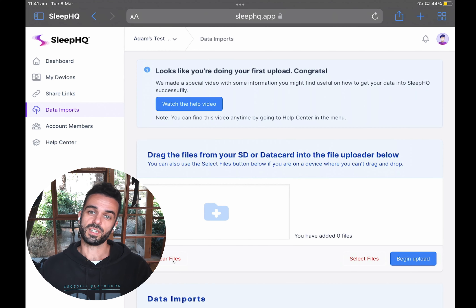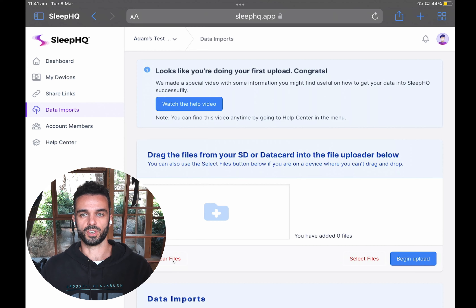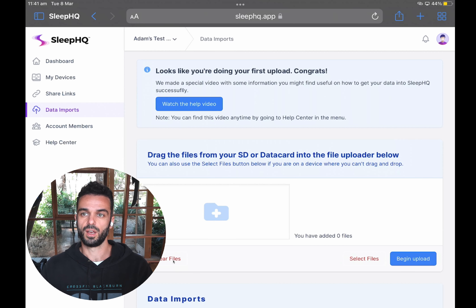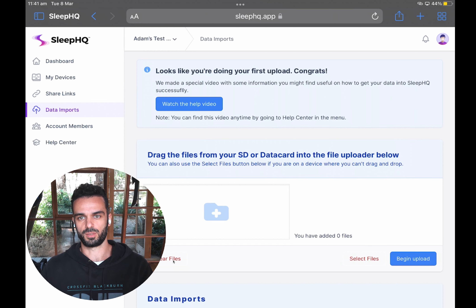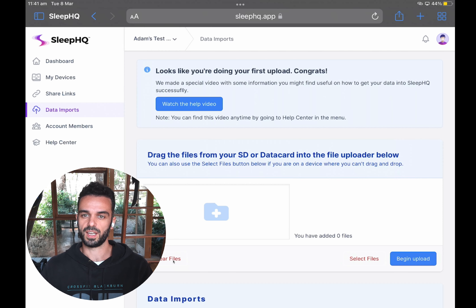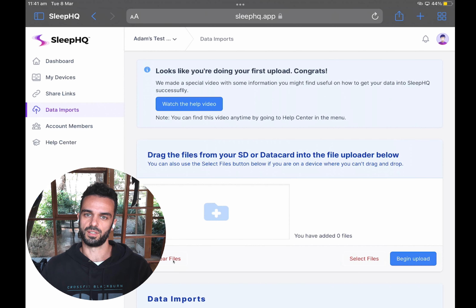Now I'm going to show you the other way to get your data imported into Sleep HQ. This works for people who can't click and drag — which you can't do on an iPhone. The method I just showed only works on an iPad. If you're on an iPhone, you won't be able to use the click and drag technique, and the same applies to some Android devices. So if you're on a device where you can't click and drag, here's the alternative approach.